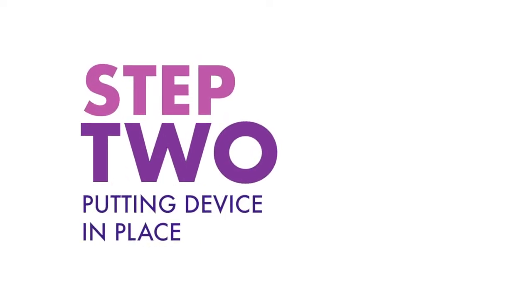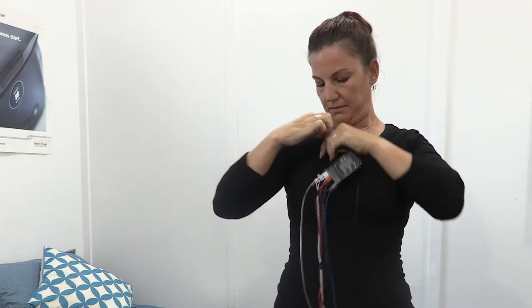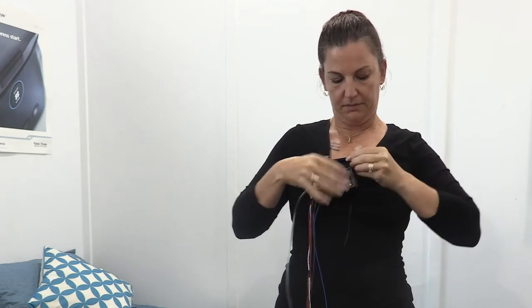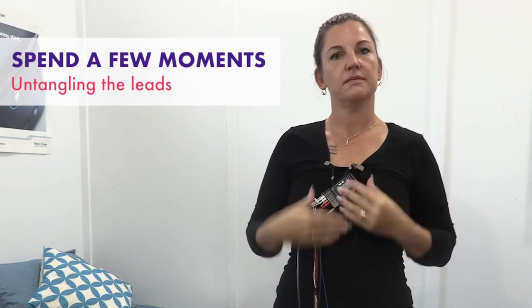Step two: putting the device in place. Attach the sleep recording device unit to your shirt or pyjamas using the clips that are attached and let all the leads hang down. Spend a few moments untangling the leads.